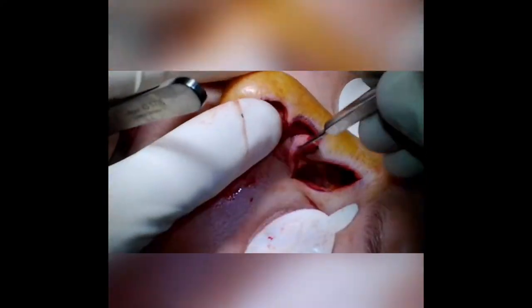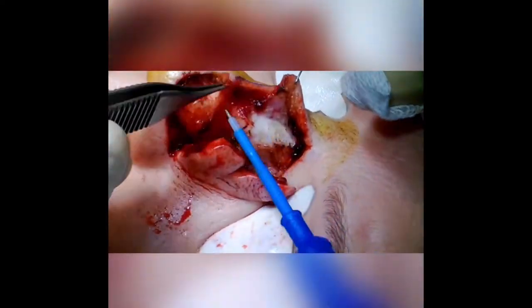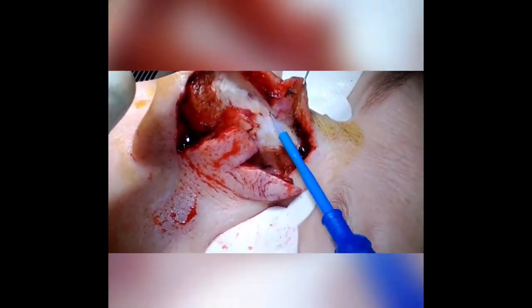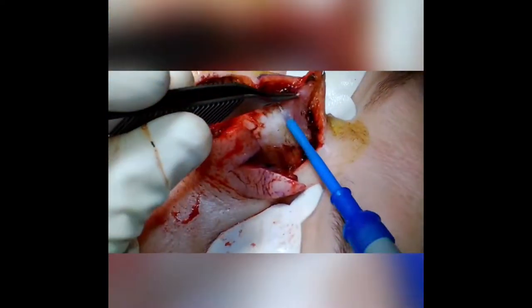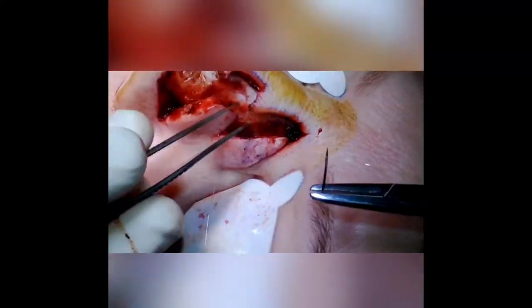Once we've elevated the flap and dried everything up, we'll undermine the rest of the nose. This is a very easy dissection in a sub-fascial plane with cautery. I'll basically elevate the dorsum and the nasal tip well past the midline, which helps us close the primary defect.